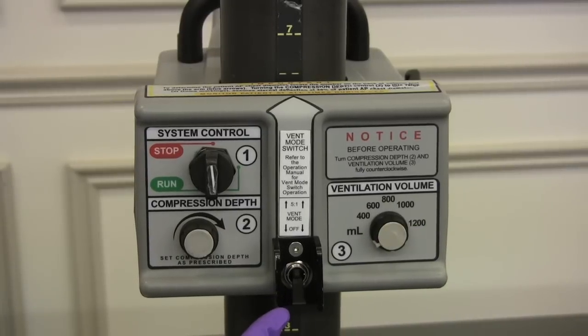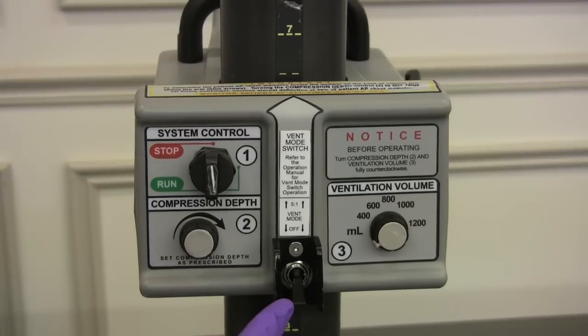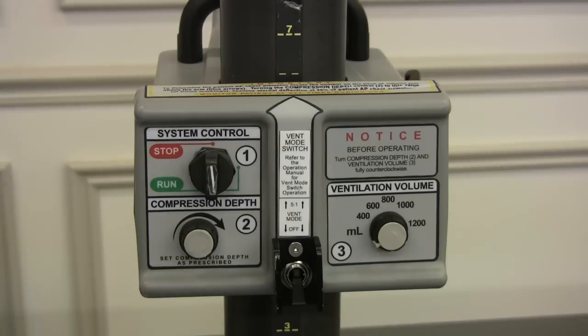This is the ventilation mode switch, which is used to select between a five-to-one compression-ventilation ratio and no ventilation with continuous compressions. To turn it on, you flip it up; to turn it off, it's down. You want to make sure you leave this in the off position.